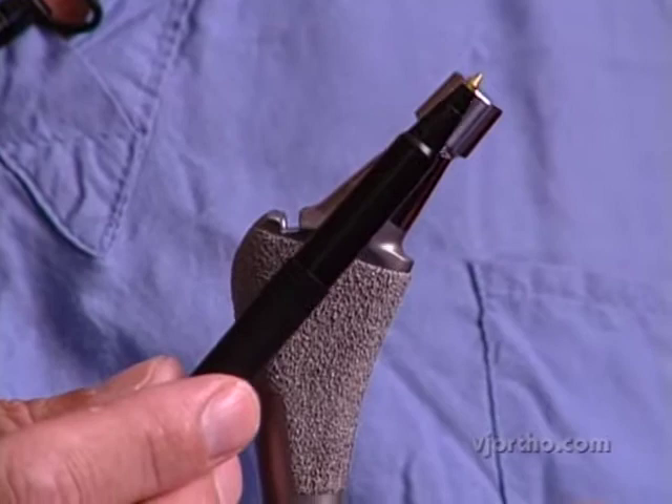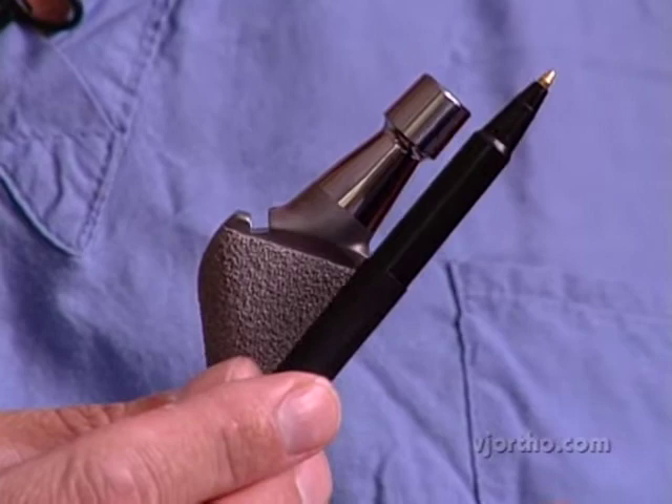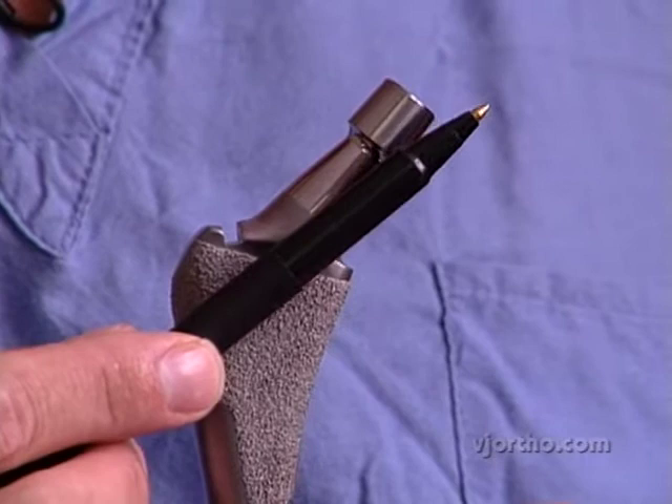When you switch from a standard offset to an increased offset, it's nice to just go straight lateral rather than changing the neck angle. Changing the neck angle is a little bit confusing because you're changing your leg length and your offset at the same time.